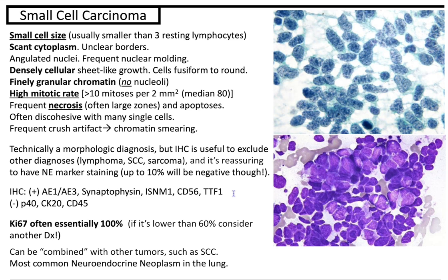Small cell carcinoma. This is small cell size, usually smaller than 3 resting lymphocytes, but of note, just larger than your reserve cells. There's scant cytoplasm, unclear borders.